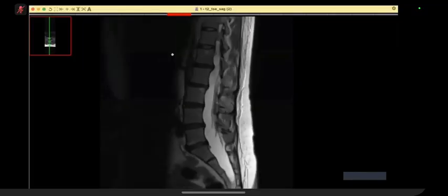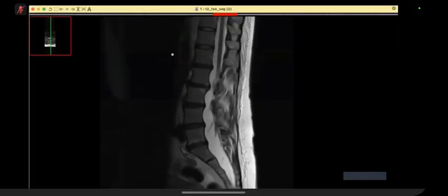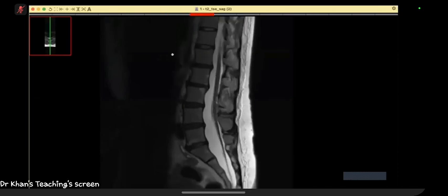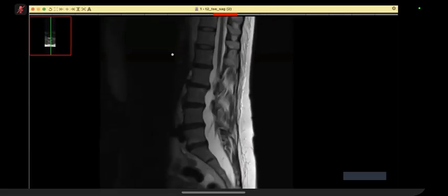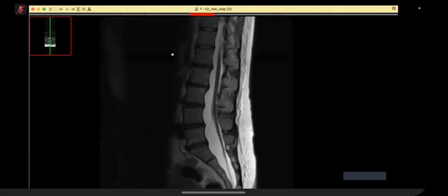neurofibromatosis type 1, which usually gives this dural ectasia, which is a neurocutaneous disorder. And with that, I'll inform the referring physician of my findings and review previous images if available. I also recommend referral of this patient to the neurosurgical team for further management.